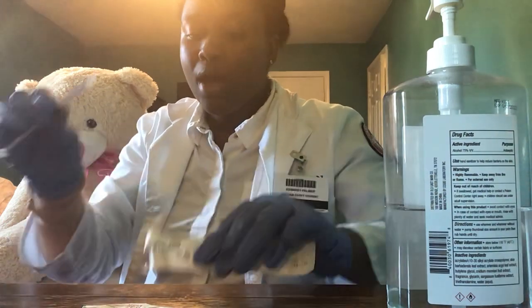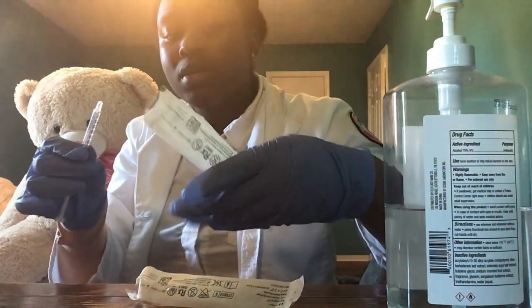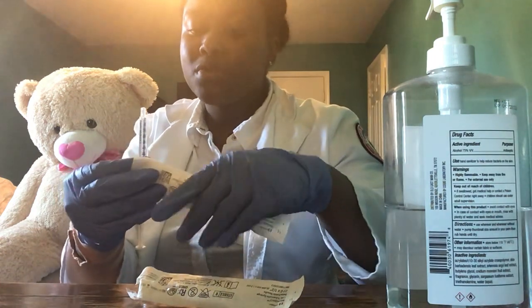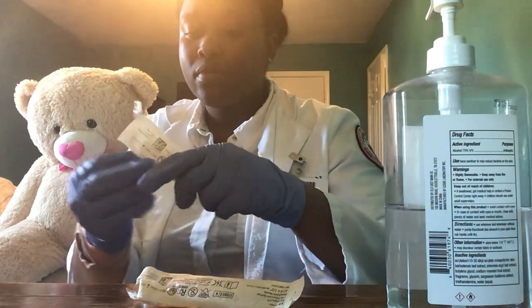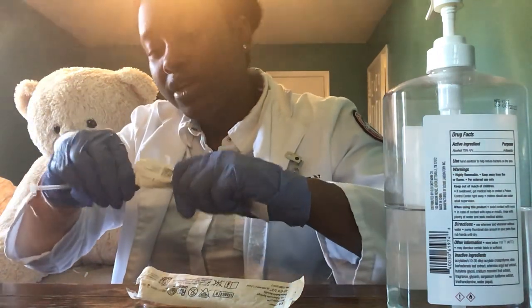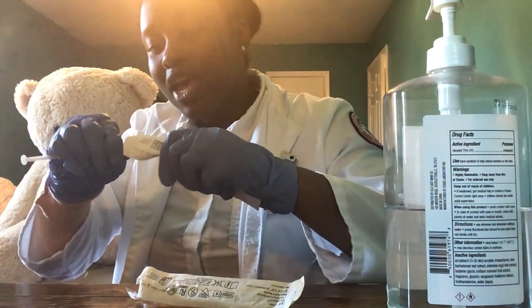Okay. Now I've removed the needle. I'm going to change into the needle that I'll be delivering the medication with. Making sure not to touch the plunger against anything to prevent contamination.